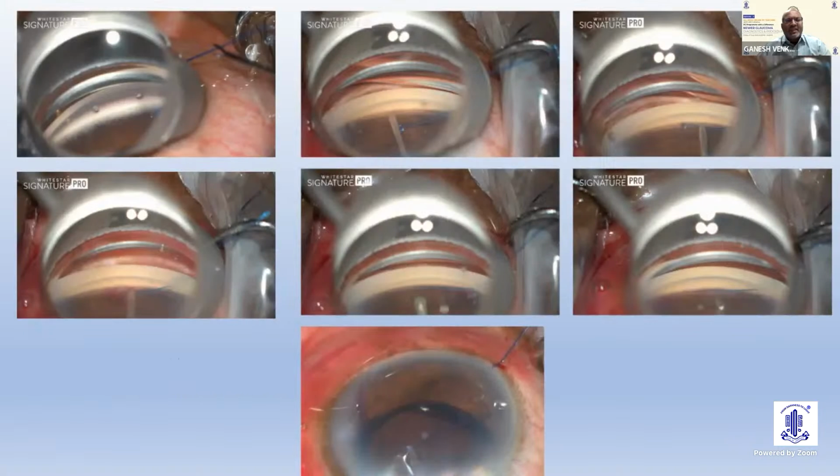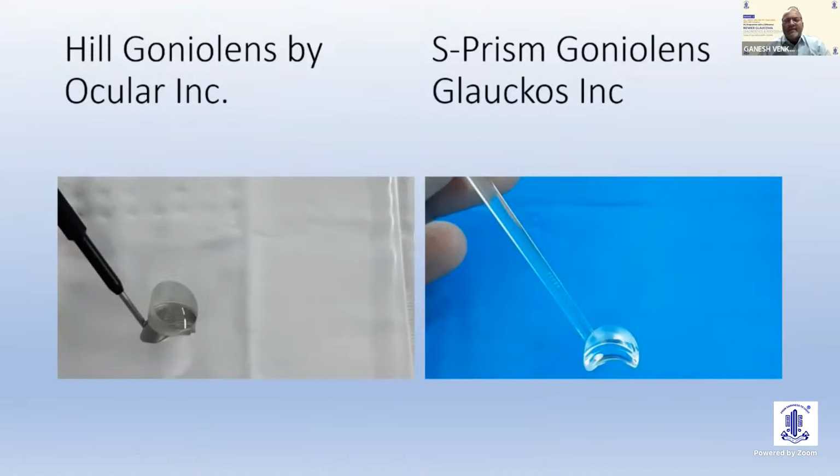cornea is very clear. And what you do is you introduce a suture into the eye, and using a surgical gonio lens, you make a small nick in the trabecular meshwork using an MVR blade or a 26-gauge needle, and you use the Grieshaber forceps or a grasping forceps to introduce the suture into the Schlemm's canal. This is a 5-0 Prolene suture, and once the suture goes into the Schlemm's canal, it will come out the opposite side, and you hold the leading edge and tug at the trailing edge, so as to open the trabecular meshwork to the aqueous humor into the anterior chamber.